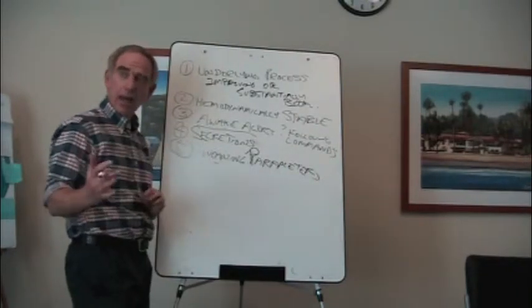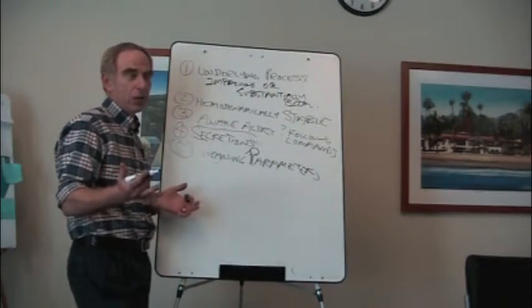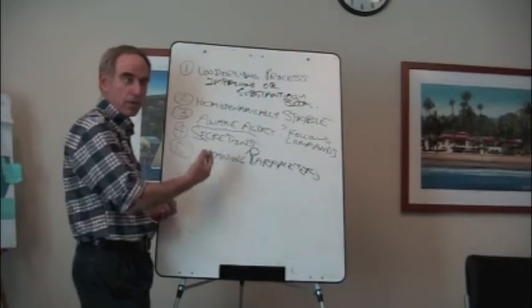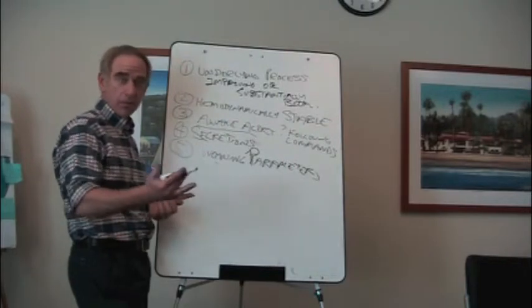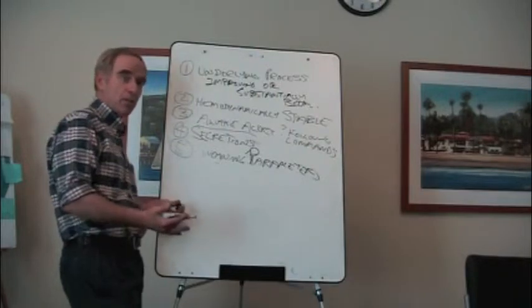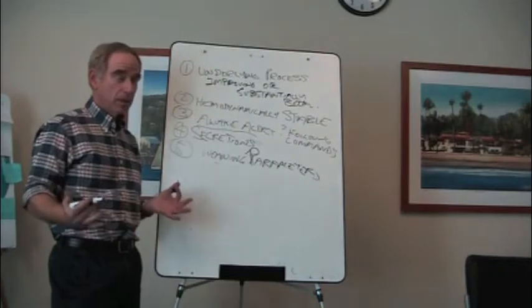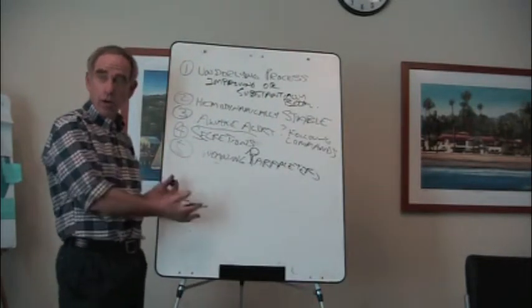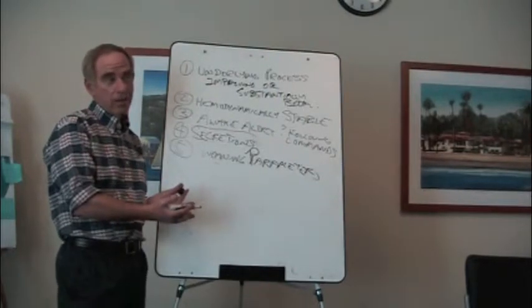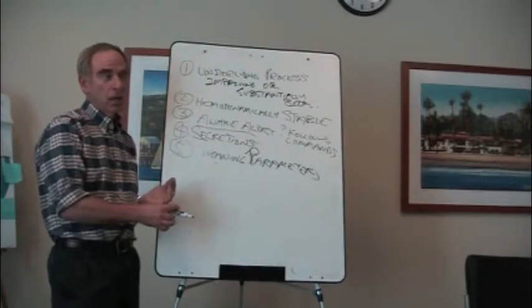But that said, all of those things tell you something, so why bother doing them if you're going to ignore them, right? Well, all of those things tell you something about your patient. I just went through the minute ventilation and all the possible things that could be telling you about your patient. If their minute ventilation is very high and their PCO2 is 40, but their minute ventilation is 15 liters or 20 liters, that patient's got a real problem. And it could be any one or combination of those problems that we just talked about, and you need to address those problems. You need to look at those. And am I overfeeding my patient?